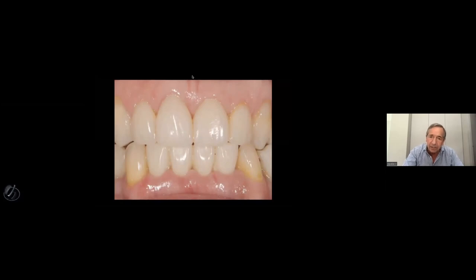You can see something interesting: using this GTO changes the color, shape, and texture of soft tissue. We still don't know why, but this is something we can see every time.